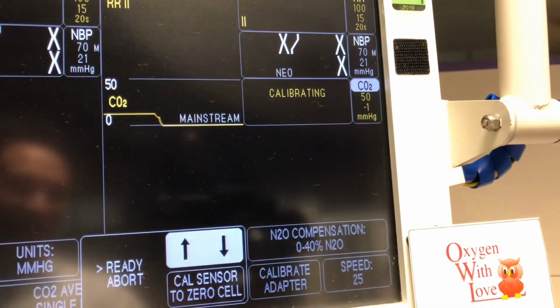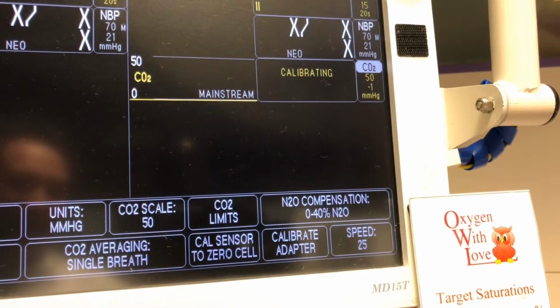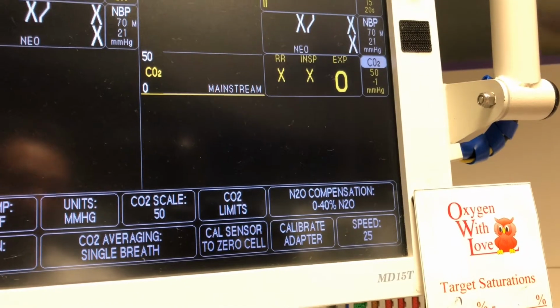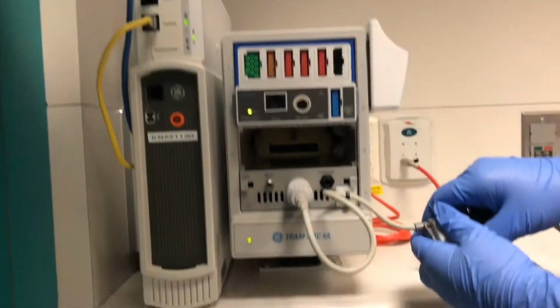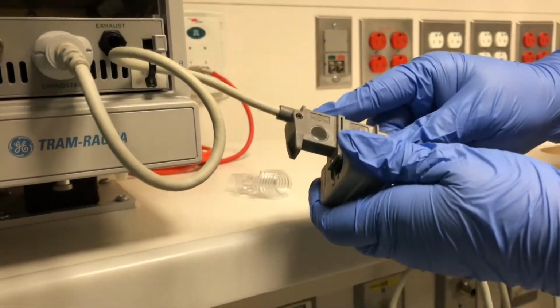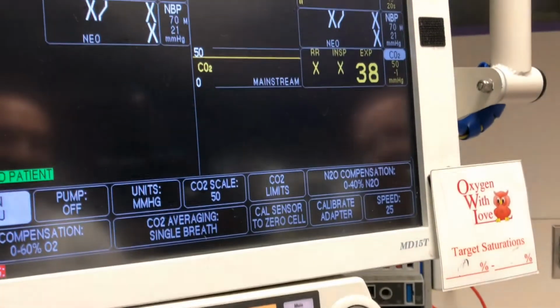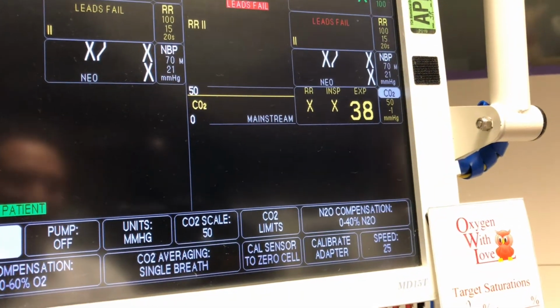And then it says calibrating up here, so you'll wait for it to calibrate. Okay, so once it's calibrated, you should see 0 there. At that point, you'll remove the sensor from the 0, and then you're gonna slide it on the one that says reference. Once you do that, you're gonna watch the monitor again. And over here, this should read 38, okay?